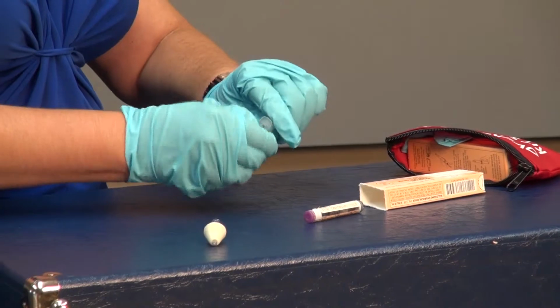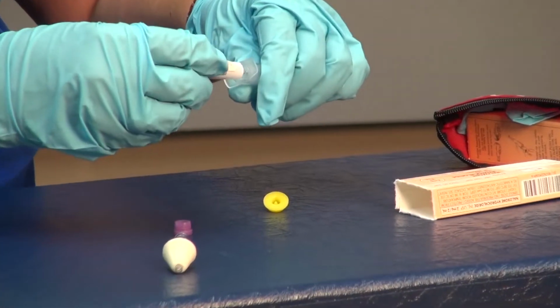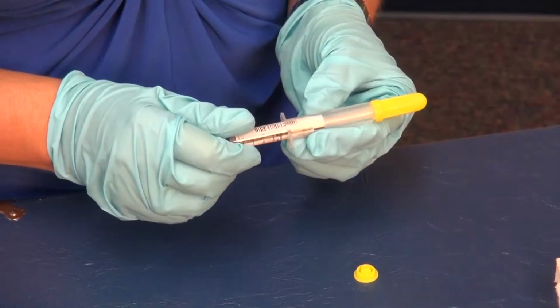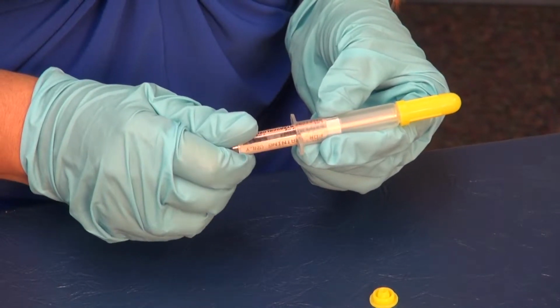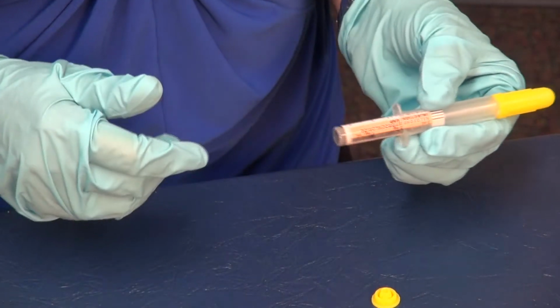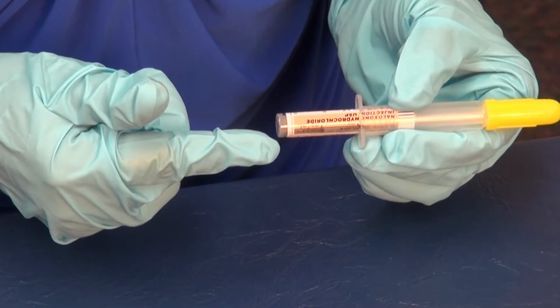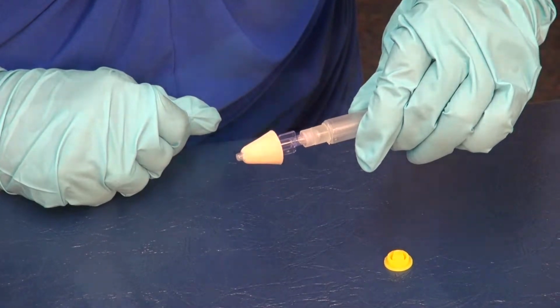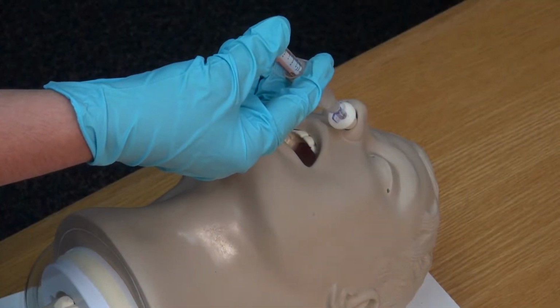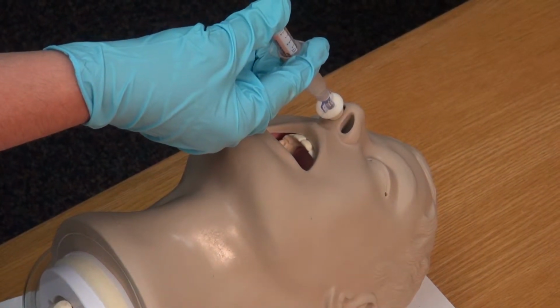First, remove all the plastic ends. Next, screw the medication into the bottom of the plastic housing. It's important to stop when you feel resistance, otherwise the liquid medication will start leaking out the other end if you go too far. Note that this device contains 2 milliliters of naloxone, 1 for each nostril. Finally, screw on the atomizer as straight as you can. Insert the device into one nostril and squeeze in half the amount, then do the same in the other nostril.